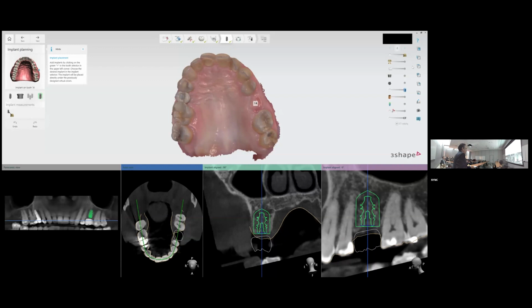And so you see now the implant here, and we see the crown, and you see it here as well. You see this crown is exactly where we want it. We know that that's where we want this crown, and we see that the implant is directly under it. We even have, it's in green, and you see this line on the outside. That's a safety that shows us that it's in bone on all sides. And the implant is in the middle, the screw kind of looking thing. So the software will tell us if we have the bone around the implant to look at.